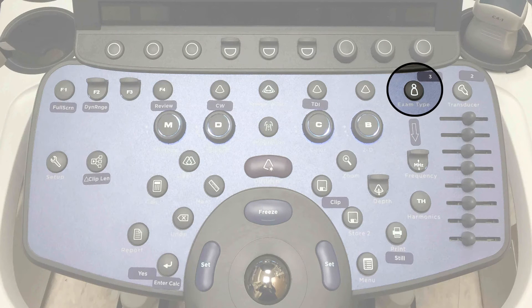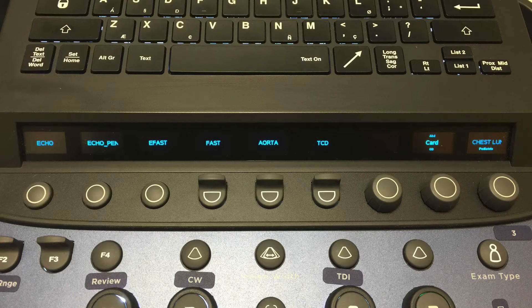You are then going to press the exam type — marked number three — to choose your preset. If you have changed probes, it will automatically display the different presets for you to select. When you press that key, the different presets will be displayed along the soft keys, and you will press the soft key corresponding to the preset and the type of study you want to do.